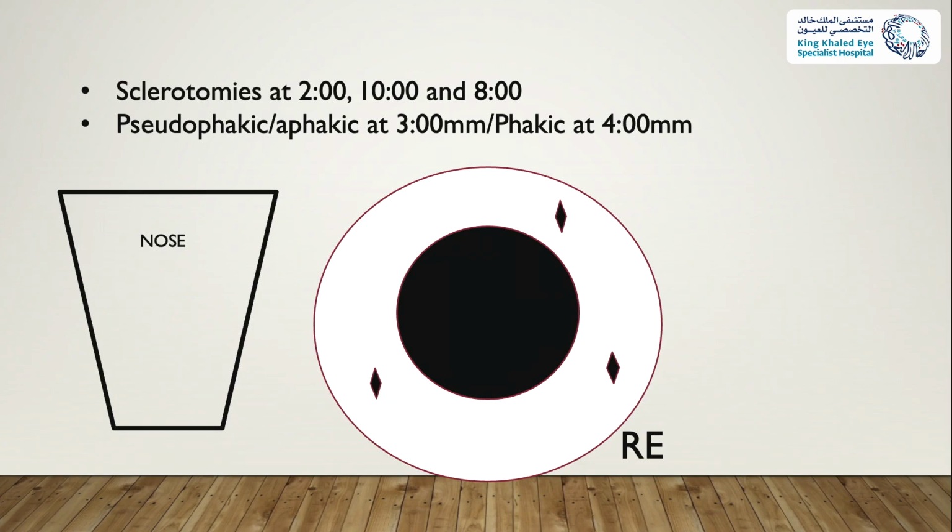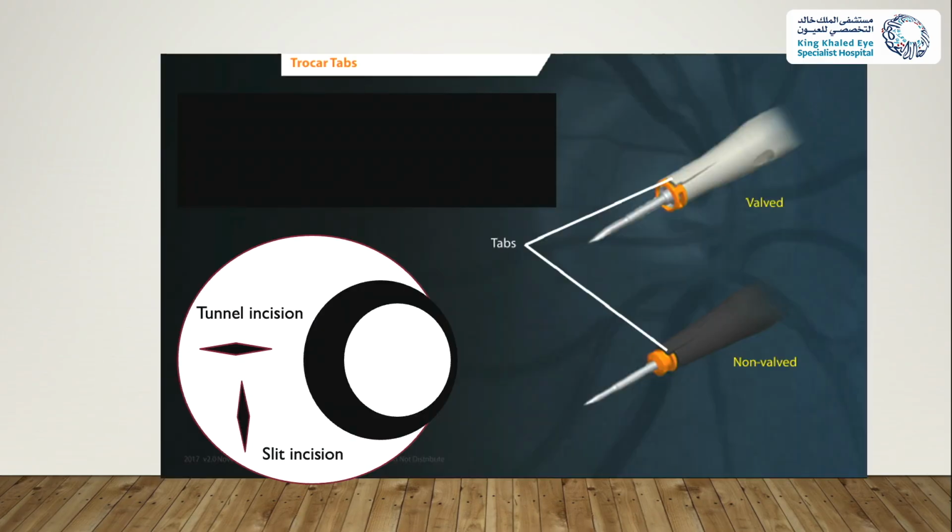I think somebody gestured to the construction of this sclerotomy. The way it was drawn, the sclerotomy is placed in almost a circumferential fashion. I'm just going to show you at this point.